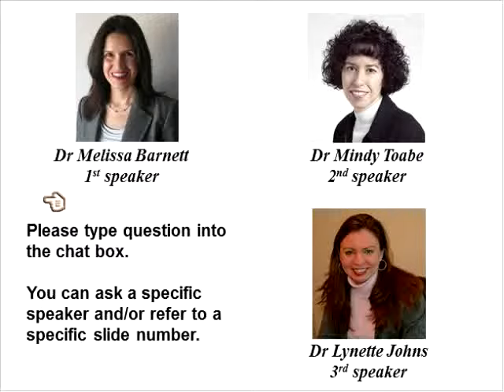But another thing you can do, if you don't get anything in about 5 minutes, and I think you said this, Melissa, have them look down and take my thumb on their eyelid, and you can sort of pump some fluorescein up under the superior edge of the lens to at least get some under there so that you can evaluate the vault. That's correct. I am pushing up against the eyelid to push up against the conjunctiva to get that fluorescein under the lens. What I usually do is I place the slit beam and I just watch as the fluorescein gets underneath, and you can see with the slit beam, even if there's a little bit of fluorescein dye present underneath the tear reservoir.